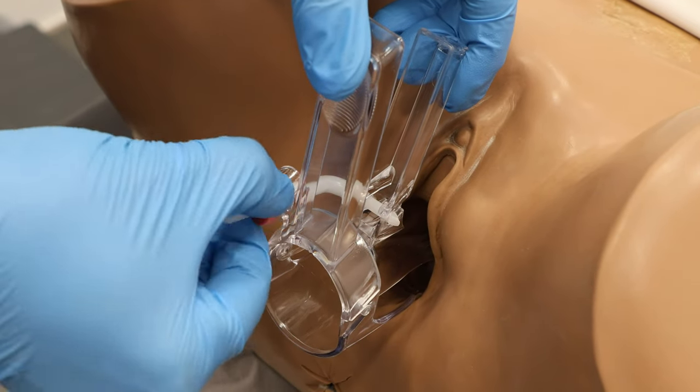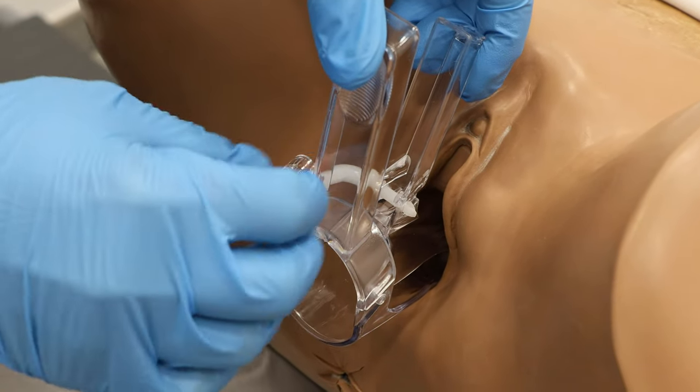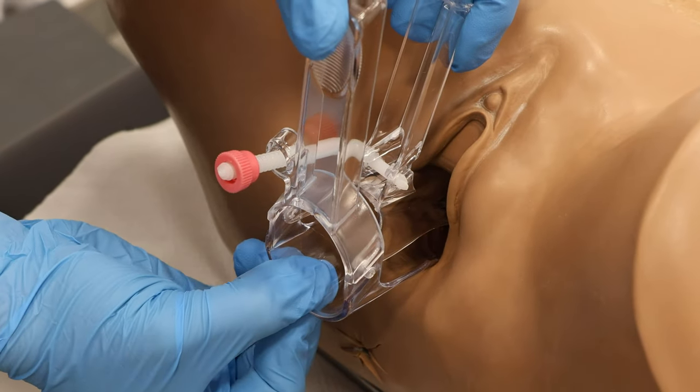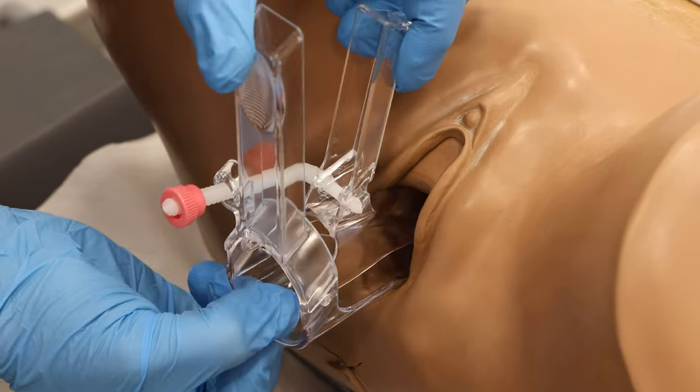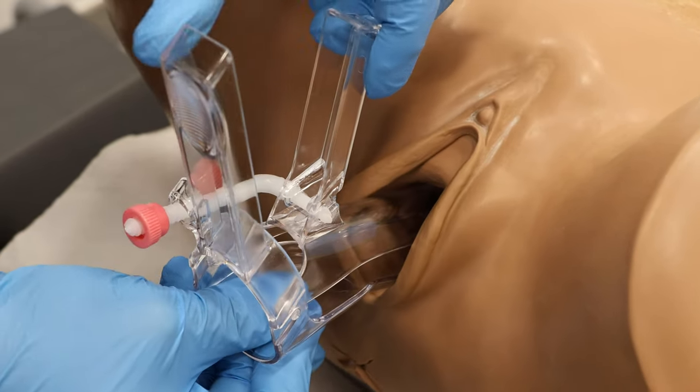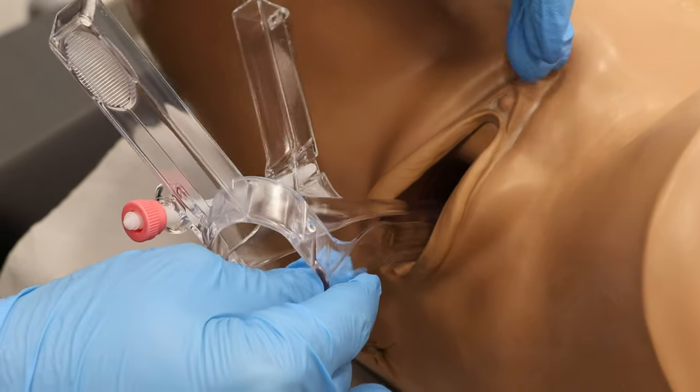Next we need to remove the speculum. First, we will retract the speculum slightly, keeping the blades open until we have passed the cervix. Then we can close the blades and draw the speculum gently in the same position, or rotate it again, and draw it out completely.